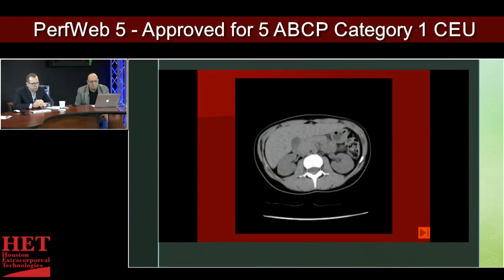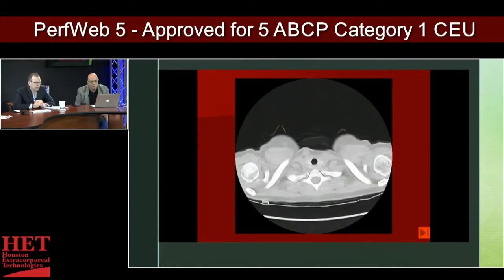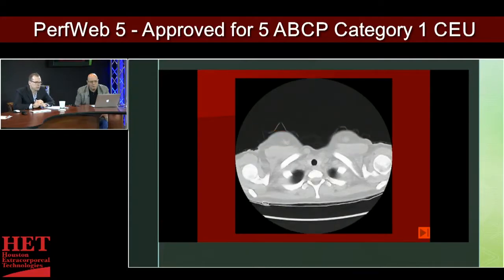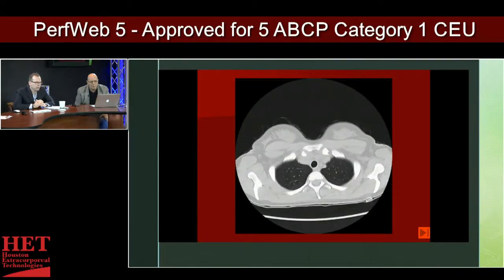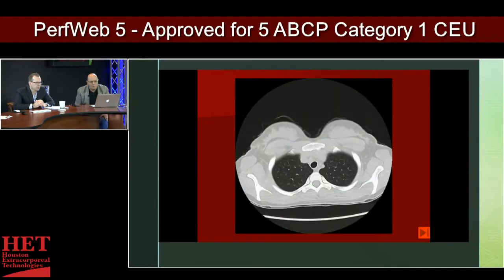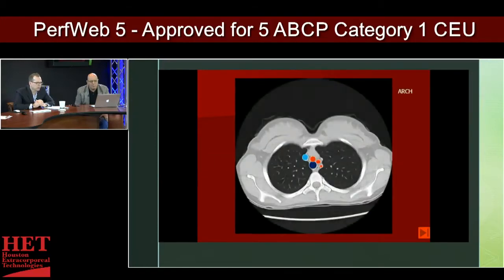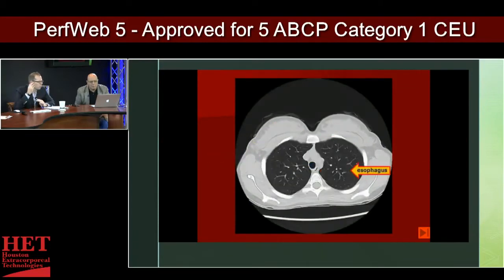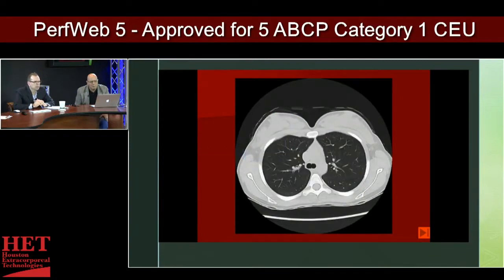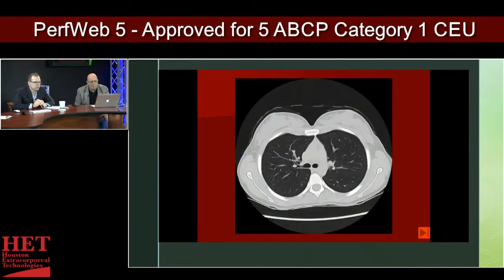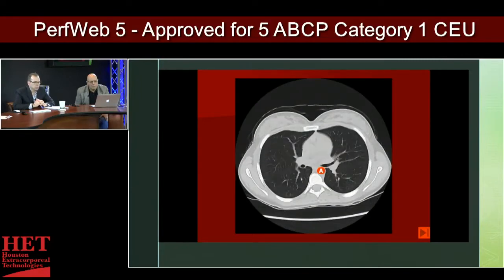You can see the various structures as it follows down all the way through the pelvis. You also have different types of views — you can adjust the contrast to show different things. This would be the lung view where you're able to see the lung parenchyma a bit better. On the previous run, the lung fields were dark — that was the abdominal or visceral view where the organs are highlighted more. By simply changing the contrast depth, you can see the lung parenchyma and lung tissues.